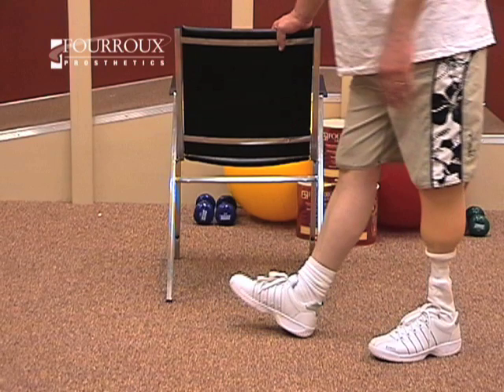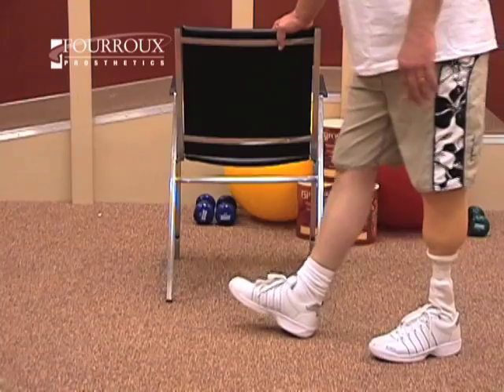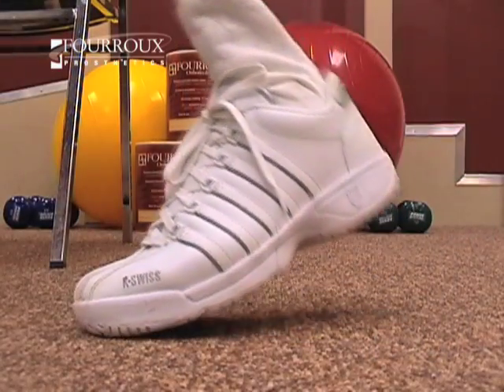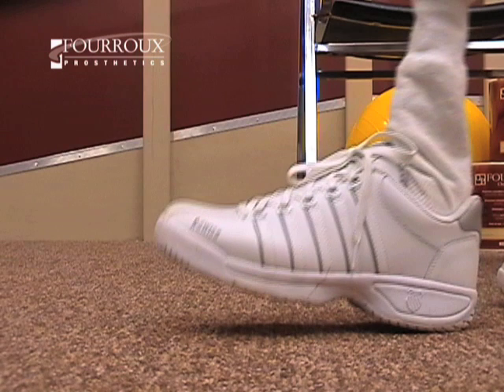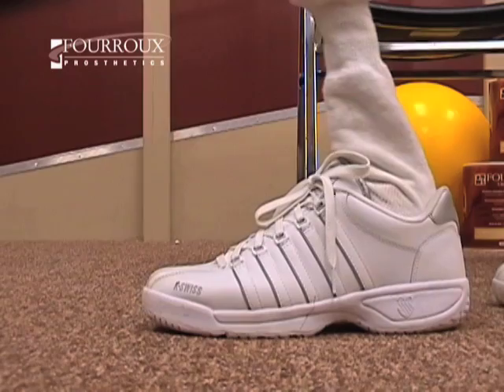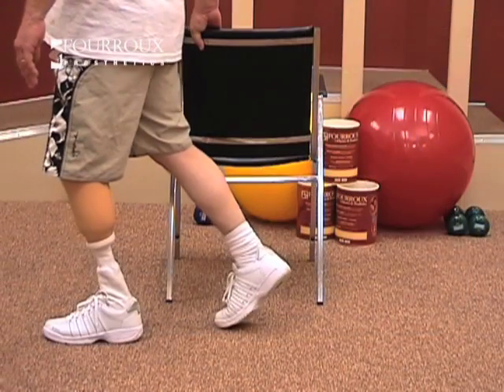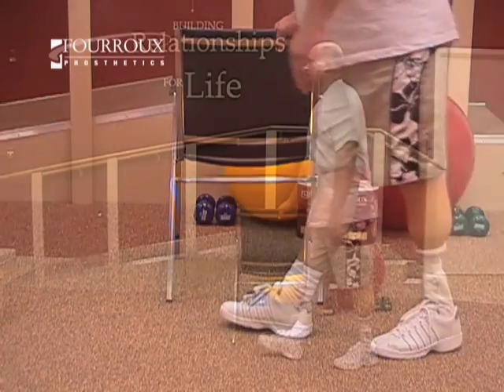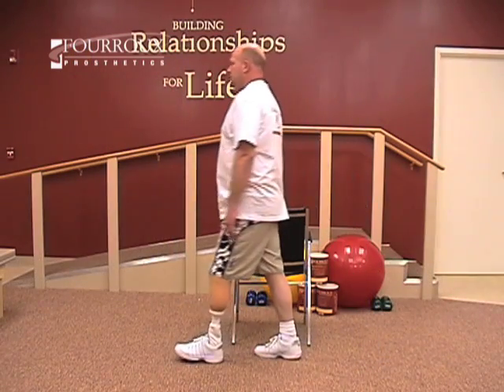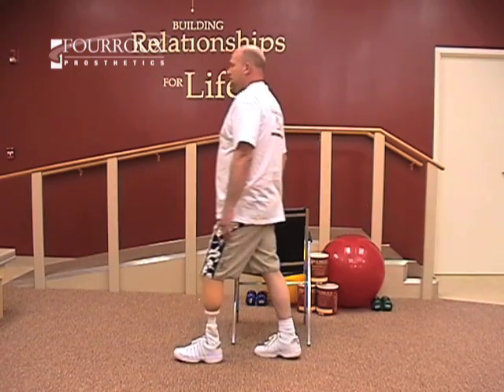Begin by standing with your prosthetic foot behind you. Focus on pushing off with the toes. Swing your leg through, and when your prosthetic foot comes back down, hit your heel first, then distribute the weight to your residual limb. Reverse the step to return to the starting position. As you do this exercise, your stride length should be the same as when you walk.